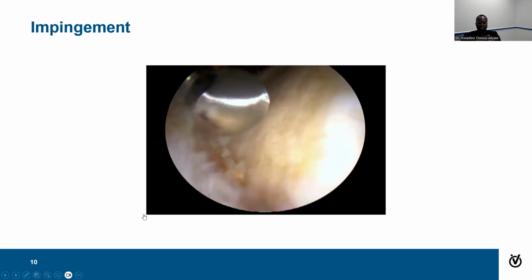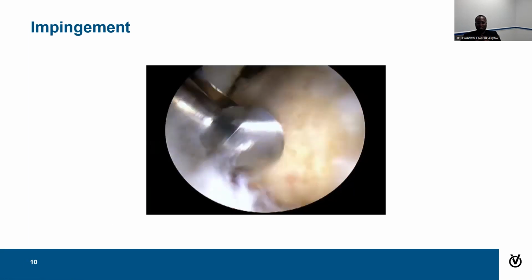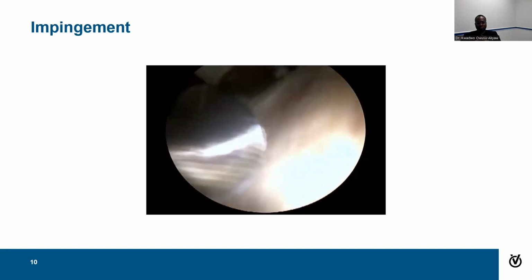Let's watch that one more time. That was a Hollywood shot. So here we are, smoothing out that bone nice and systematically, okay? And it takes nice, smooth movement, good control, good visualization to make sure we can see what we're doing. All right, we can go to the next slide.